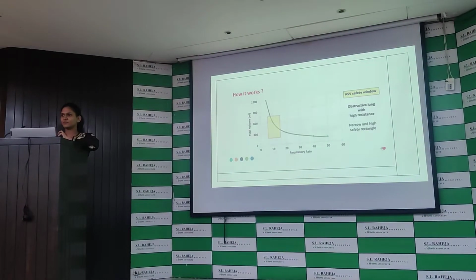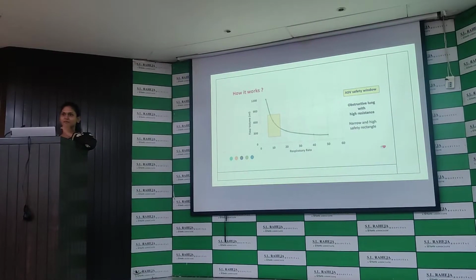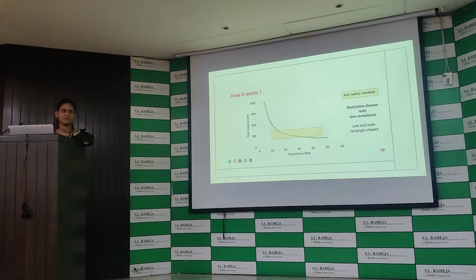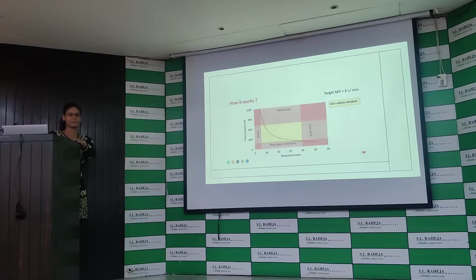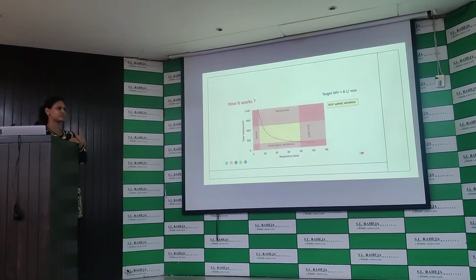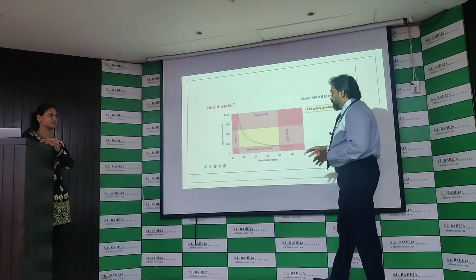So what is happening here is, if you look at it now, the ventilator is knowledge based. What is it doing? It is actually figuring out the compliance. It is figuring out the resistance. It is doing all those things. So it is understanding obstructive airway disease, it is understanding restrictive airway disease. So if it was normal, this is how it is.